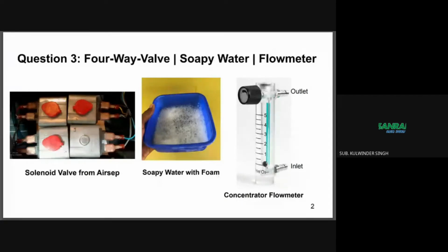We have to check the four solenoid valves. We can check them with a multimeter also. The resistance varies from 800 to 4200 ohms depending upon the model.